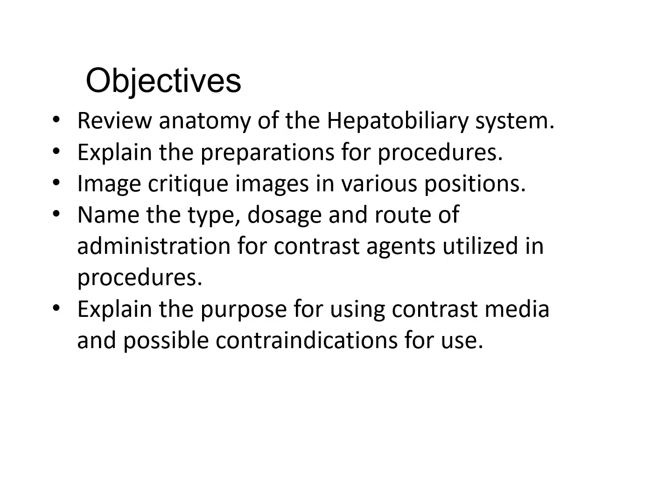All right, so we're going to talk about the anatomy of the hepatobiliary system and explain the preparations for the procedures. Most of them involve injection of iodine contrast via some method. The route of administration varies from procedure to procedure, but you don't use barium. You use iodine contrast, and you try to inject the bolus and get it into the biliary duct system.